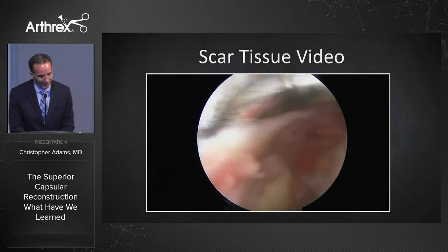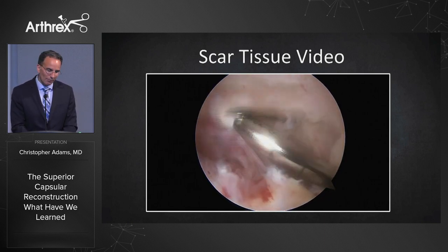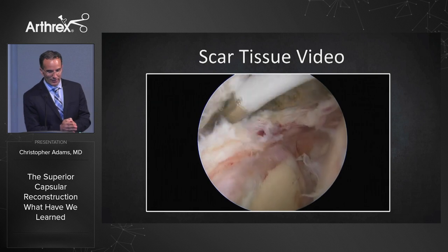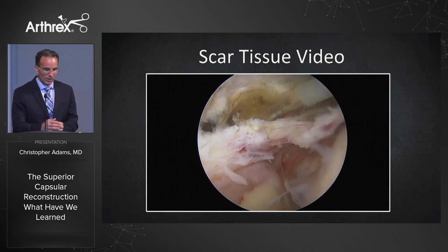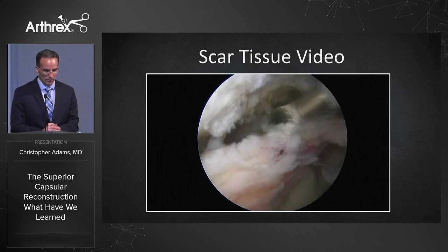Key point one: it's very important to mobilize the cuff, which is a good investment to make. Here I'm freeing up the scar tissue in the lateral gutter — you want to free up all the scar tissue to see, first and foremost, if you can fix the rotator cuff. Because in a lot of cases you're able to fix it. In this one we're not. We're freeing up the scar tissue with the Apollo RF, right on top of the cuff. It's a little bit of sculpting here.